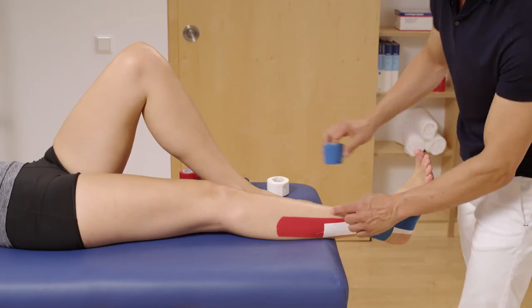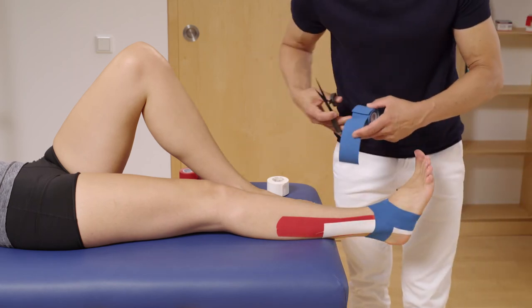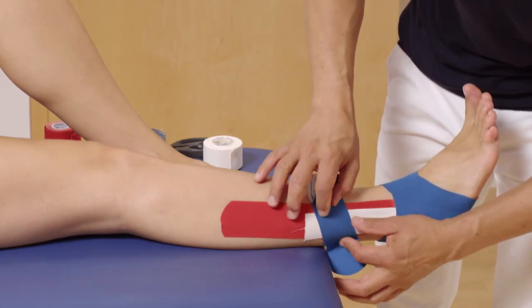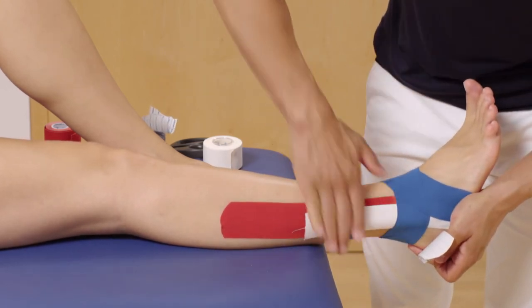Cut off one more LoicaTape K strip of around 10cm length and round off the edges. Apply the strip vertically to the first two tape strips at the lower leg to fixate the first two strips. To finish the application, rub on the tape.